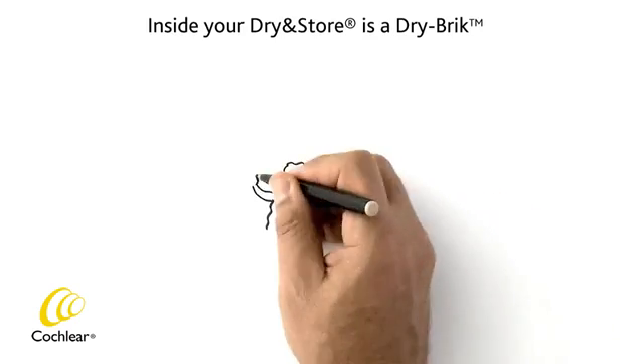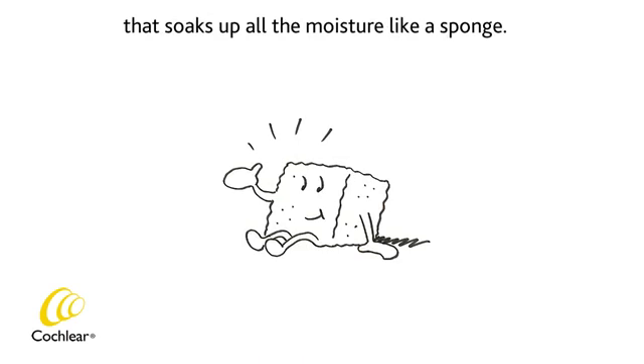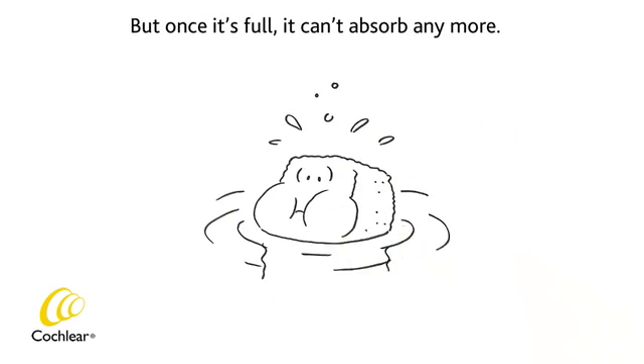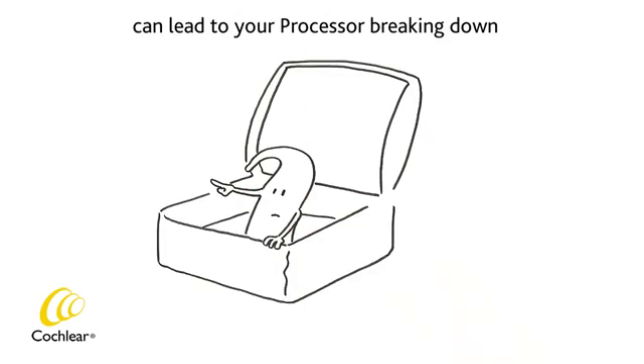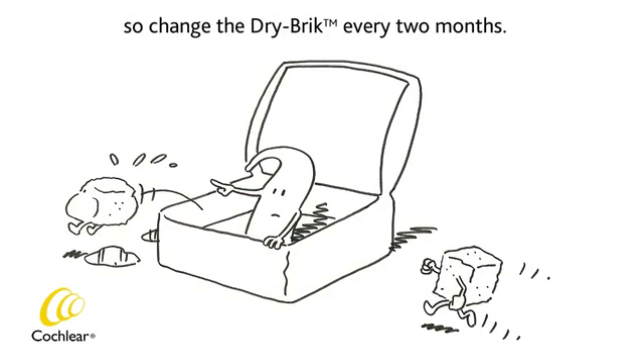Inside your dry-in store is a dry brick that soaks up all the moisture like a sponge. But once it's full, it can't absorb any more. A dry brick that is wet on the inside can lead to your processor breaking down, so change the dry brick every two months.